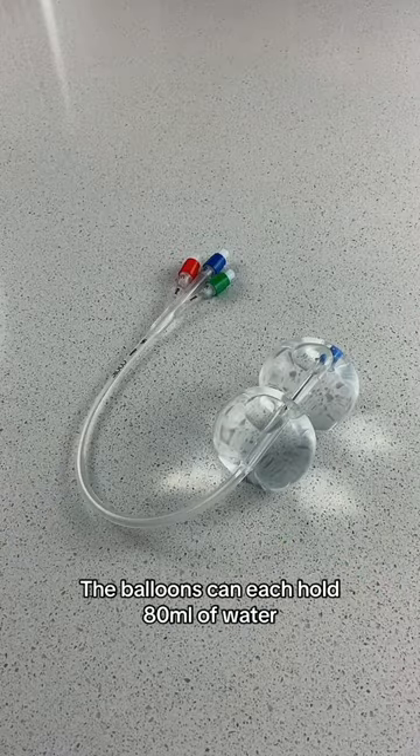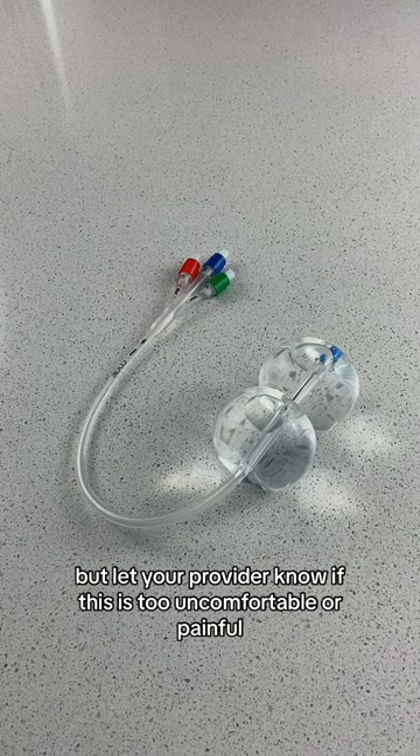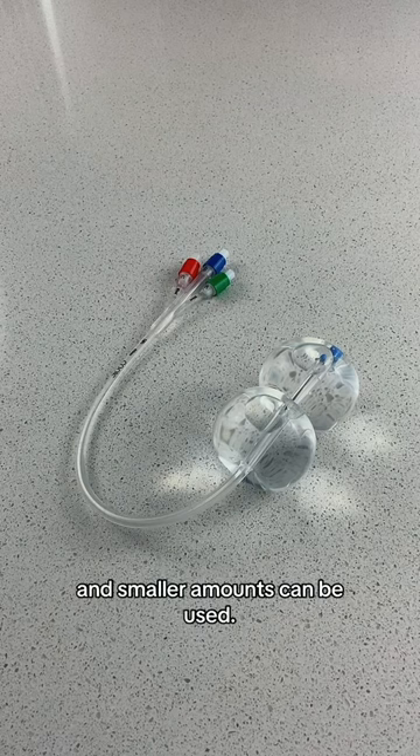The balloons can each hold 80 milliliters of water, but let your provider know if this is too uncomfortable or painful and smaller amounts can be used.